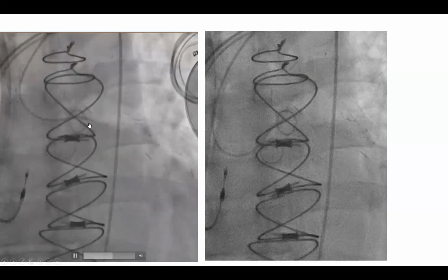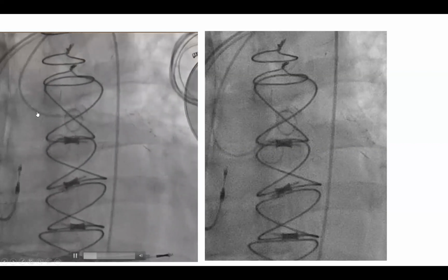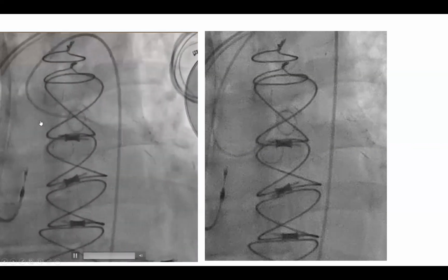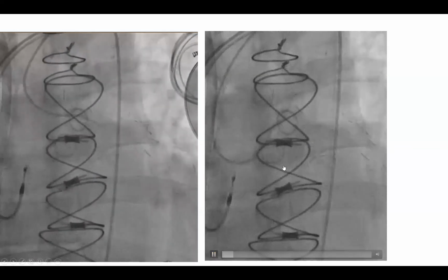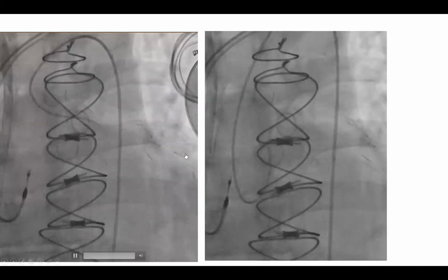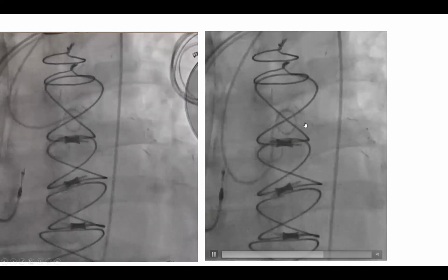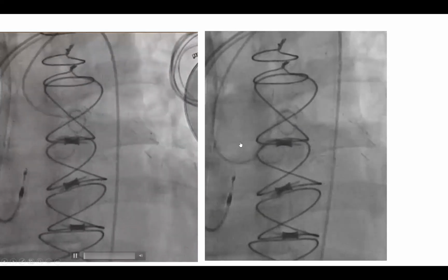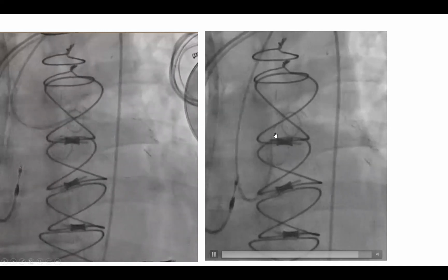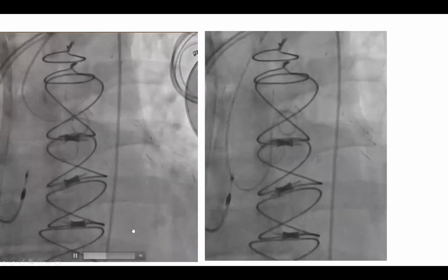So what we did, we immediately changed. We started to push, and as we're pushing, you see the catheter tip was starting to come out. And here we pushed further, and we torqued it. So usually we keep pushing, and when the catheter is close to coming out, you torque it, whether clockwise or counterclockwise, and it will flip totally out. See how by keep pushing it, we made it very duck-shaped, and we were able to push it out of the coronary. So push is what works.